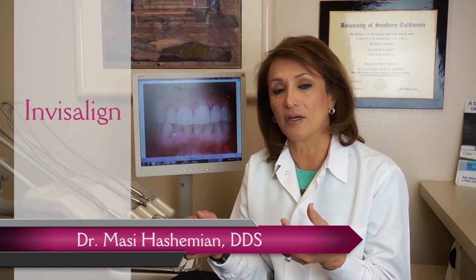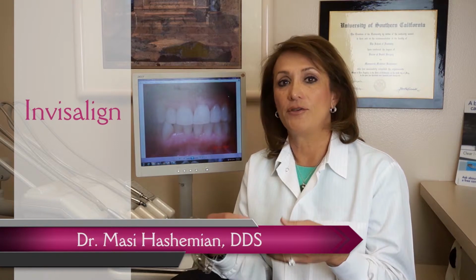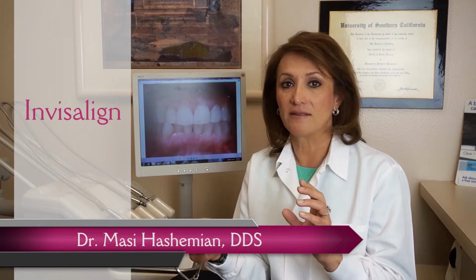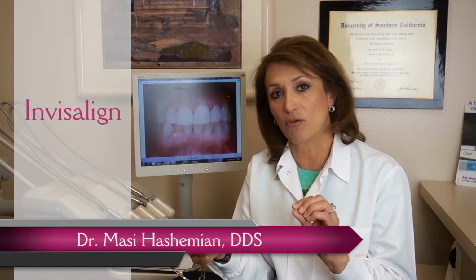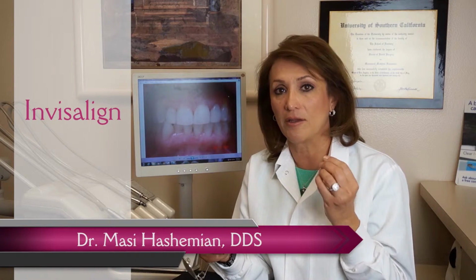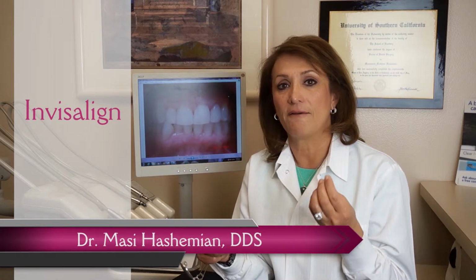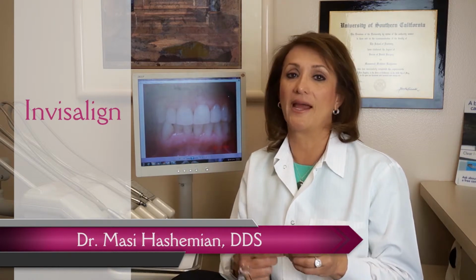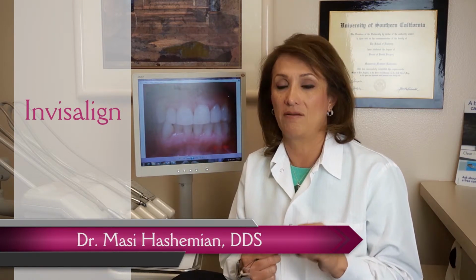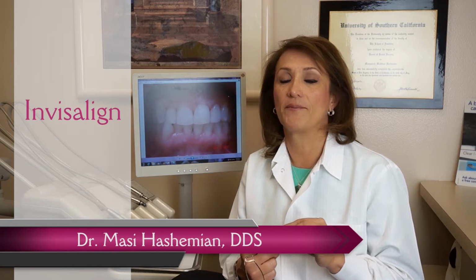So it's kind of tight and uncomfortable when you put it on, and then in 2 weeks it's going to be very comfortable. Then you get another set of new aligners, tight, you wear it, it fits in 2 weeks, and it gradually moves towards our goal to where the teeth in the upper jaw and lower jaw are going to fit together correctly. It's very important to wear these aligners all the time, except when you eat or drink.